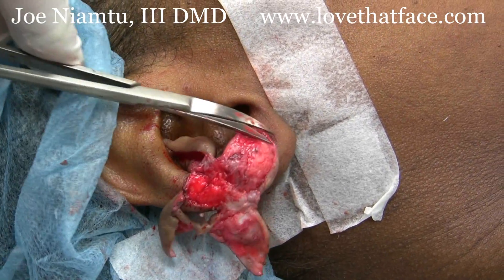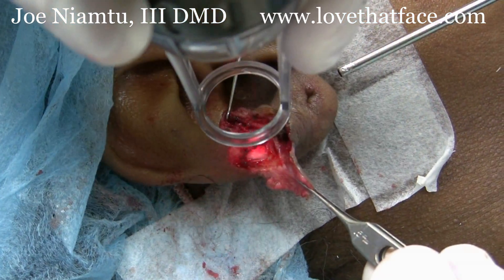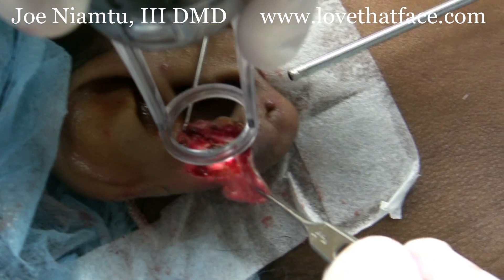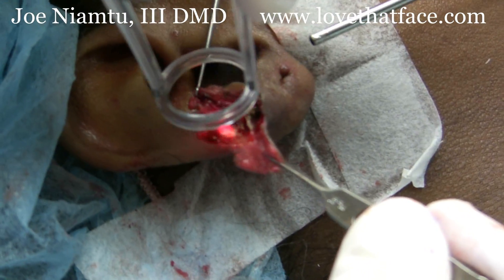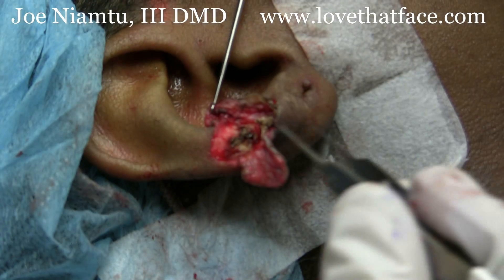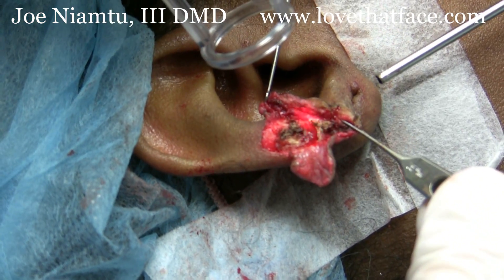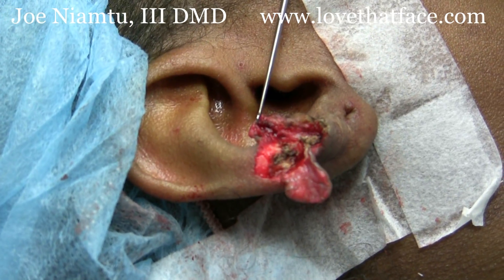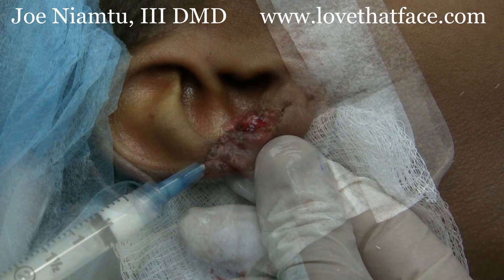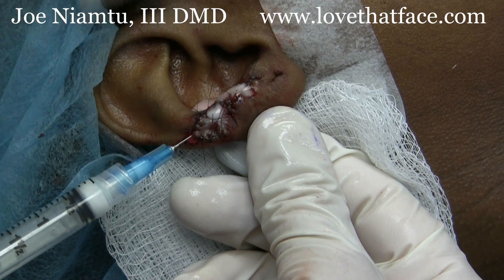First we're going to laser everything with the deep FX fractional laser. Now we're using the deep FX to laser any residual base of this keloid. Now we'll put the skin back together and close this and put some steroids. You can see our suture line and we're putting some Kenalog 40 in here.